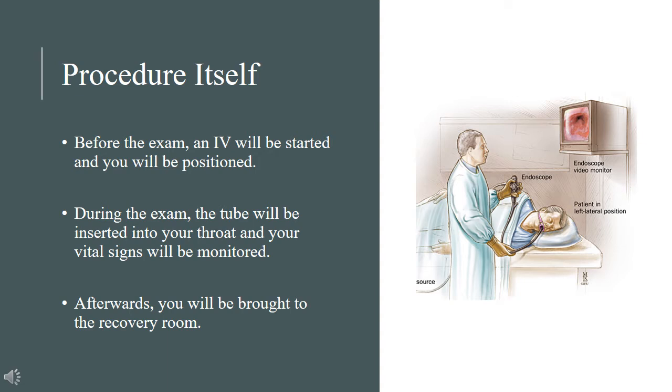Before your exam, an IV will be set up, which will remain in your arm throughout the duration of the exam. There will also be a numbing agent applied to the back of your throat. The doctor will position you lying down on one side on a table. The doctor will place a mouthguard to protect your teeth and the camera. The exam should last no longer than 15 to 30 minutes. After your procedure, you will be escorted to the recovery room, where you will remain until the sedative has worn off. This may take up to an hour.